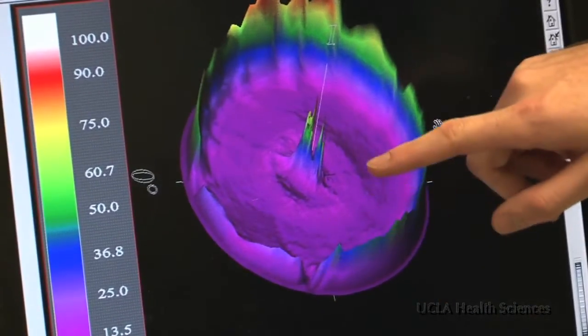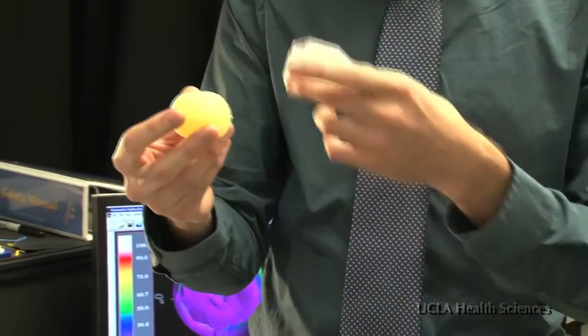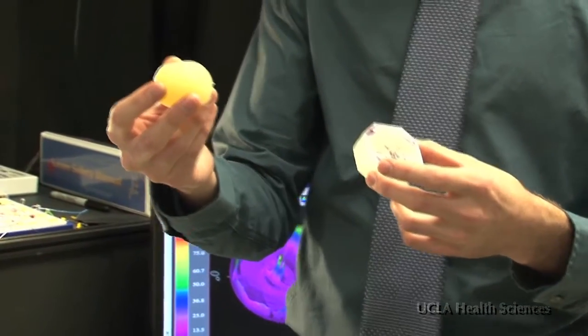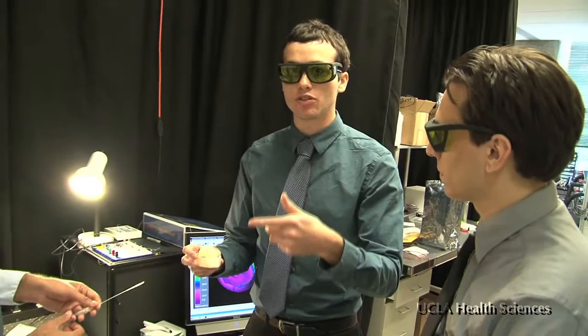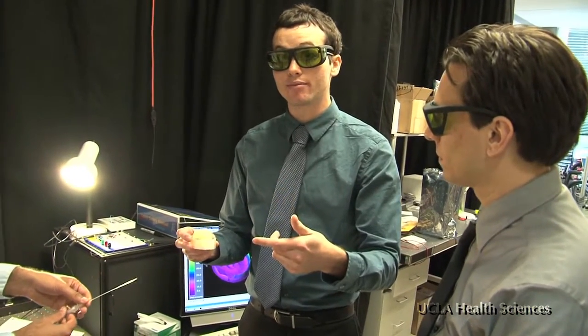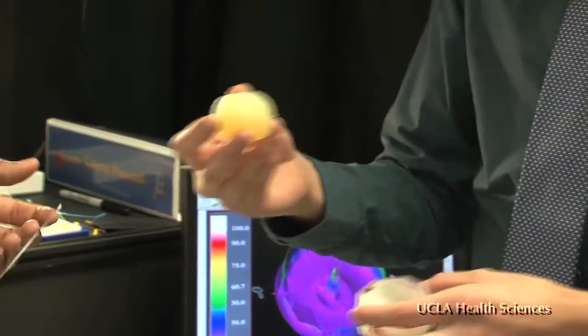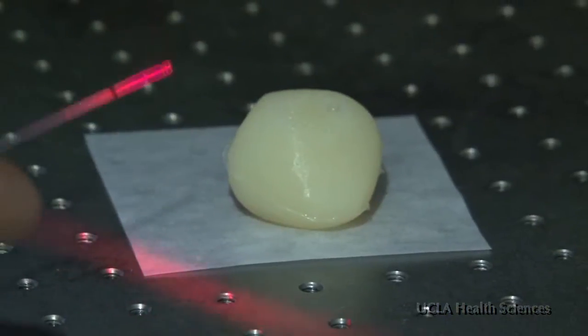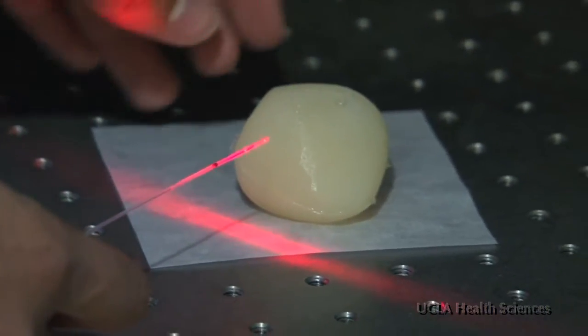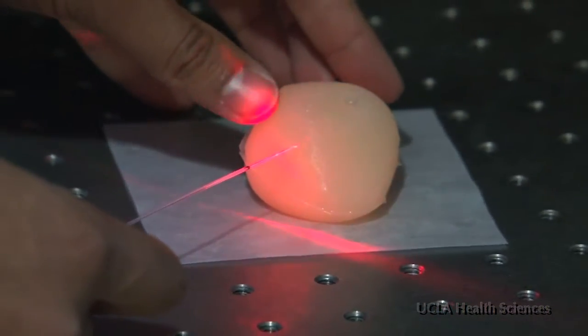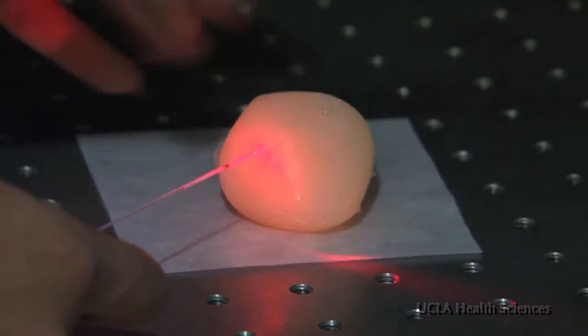We are hopeful that this treatment can soon be achieved in a doctor's office under local anesthesia. This is a replica of a real prostate. It'll actually turn white once the laser fiber heats it up to the same temperature the tissue would be damaged at. What we're doing here is inserting this laser fiber into the prostate replica and showing what would happen in an actual treatment.